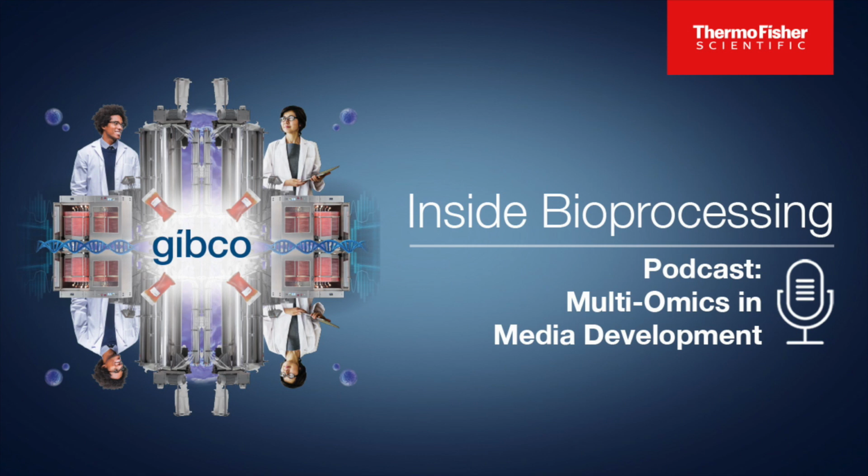So in our CHO cell based expression system, genomics, transcriptomics, proteomics, and metabolomics are all key omics. But usually from genotype to phenotype, proteomics and metabolomics are closer to phenotype. So we think proteomics and metabolomics are key omics within process development workflows.